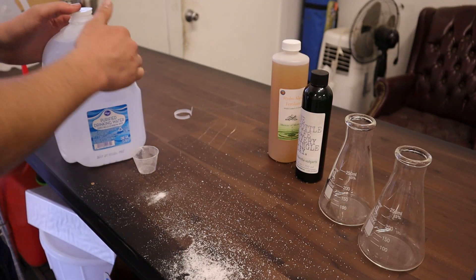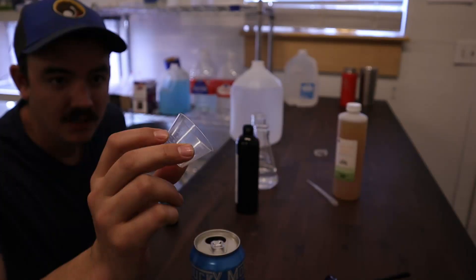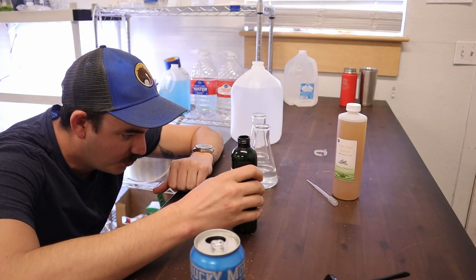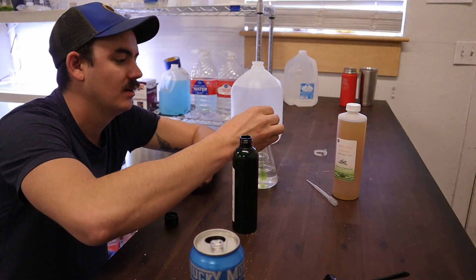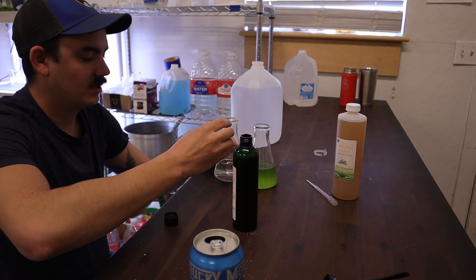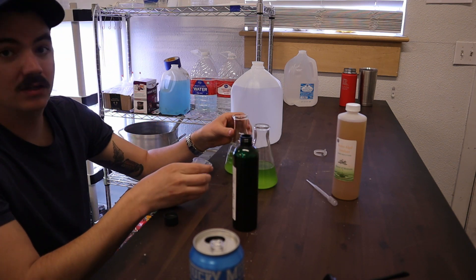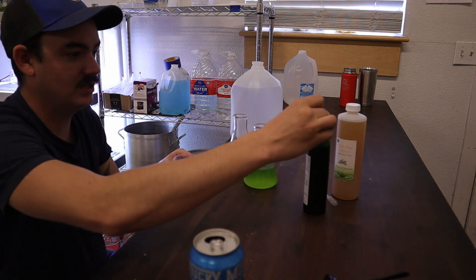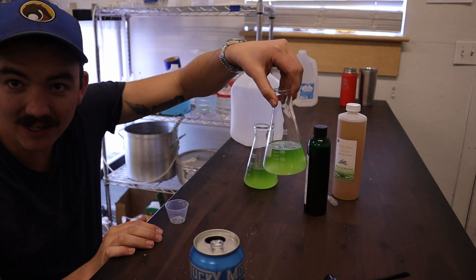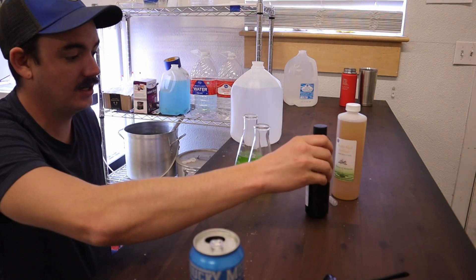We got our gallon with our half cup of Instant Ocean. Let's shake this up. We want 10 mils per flask — what a pour! Pour these into the flasks. Look at these beauties, unbelievable. They look so good with that light coming behind them. We put 10 mils of the chlorella in there.